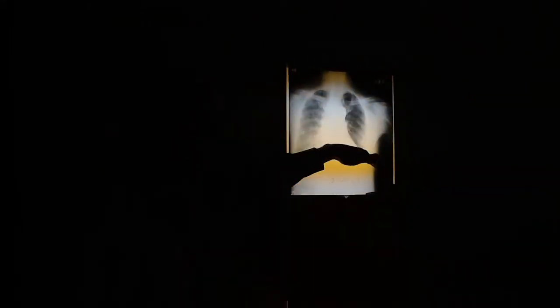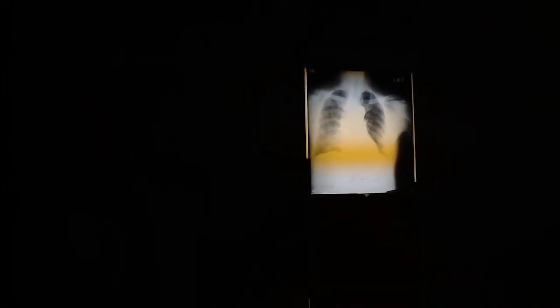That's homogeneous density. There's still lots of air in there, isn't there? But yet that's not normal looking. These lungs don't look like those over there, and those are normal. There's too much density. It's an increase in the density all over both lungs. It's very subtle, but that's not normal density, is it?